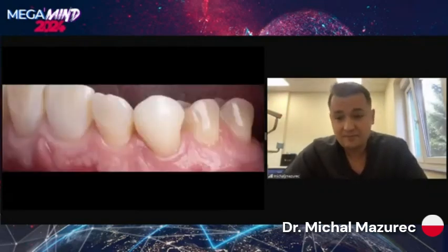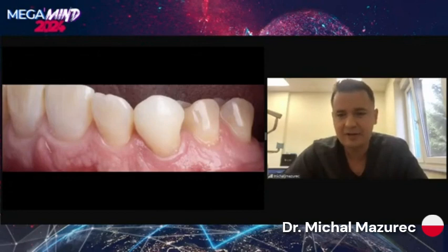Perfect soft tissue, perfect outcome for aesthetic reasons. There is a huge, very high papilla, so we achieved everything possible. So, good 3D position, we managed the grafting, everything.